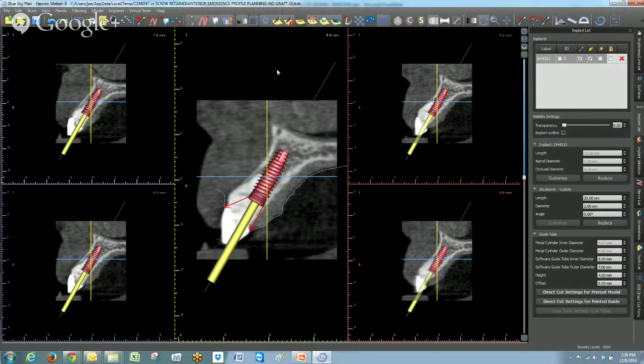You can take these abutments sometimes, depending upon where the screw hole is, and you can cement the crown to the abutment before you put it in, and just leave a small hole for the screw access. Now, if it's an angulated type of an abutment, you can't do that, but at the same time, you can create a margin that doesn't have a deep sulcus, and that's all very maintainable and controllable when you cement your crown on.